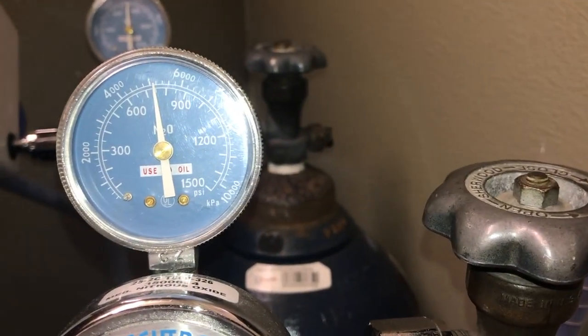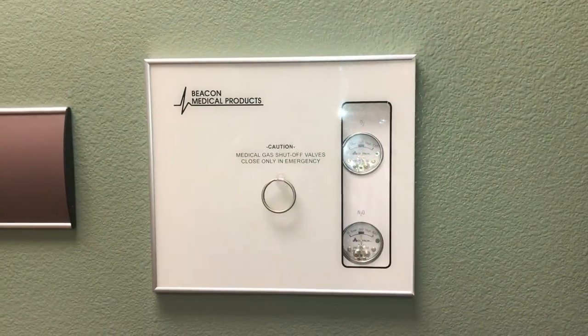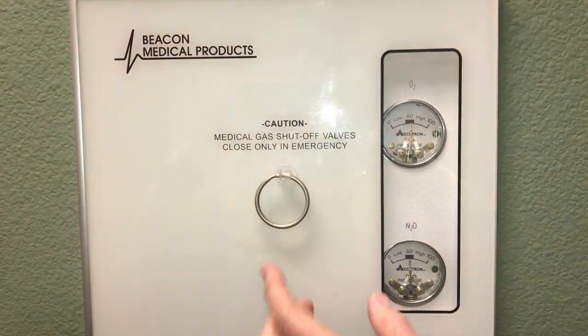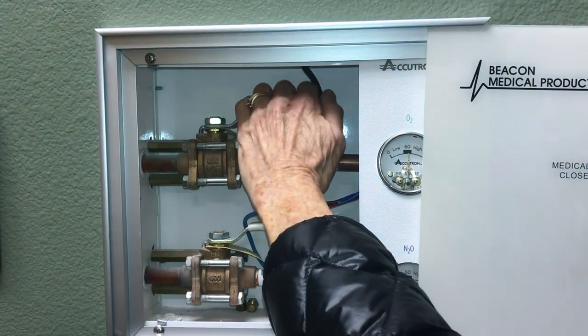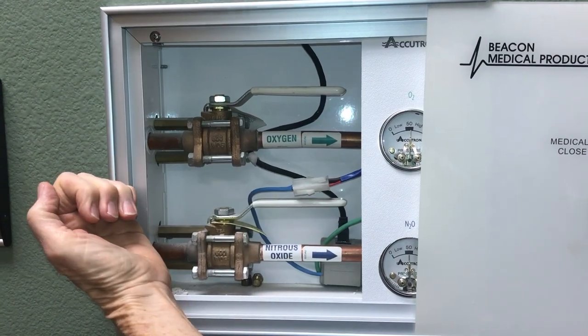Here is a nitrous gauge. The next system is the emergency shut off valve. Faculty would be required to shut this off in the case of an emergency. The valve levers are pulled outward towards you to shut off the oxygen and the nitrous oxide system.